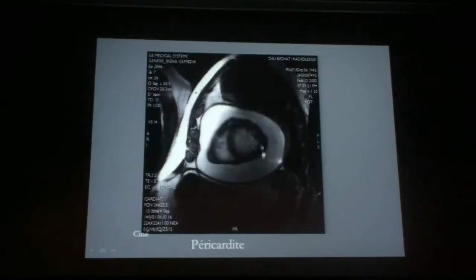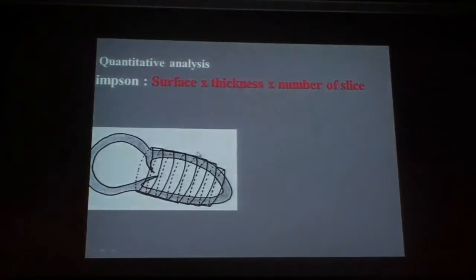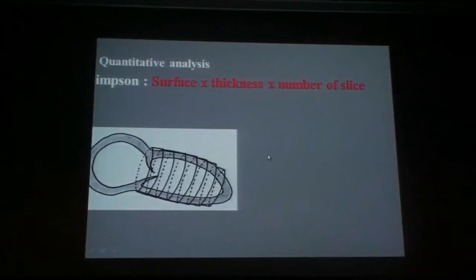You can also see over here with the T2 on T1 weighting, these sequences are weighted T2 or over T1 depending on the alpha. You can see over here a hypersignal pericardial fluid that is major and that is basically compressing the walls of your heart, which will develop some other signs that we will see later. So how can you quantify this ejection fraction?